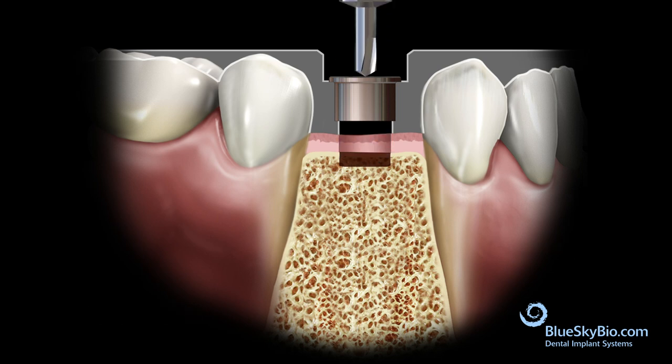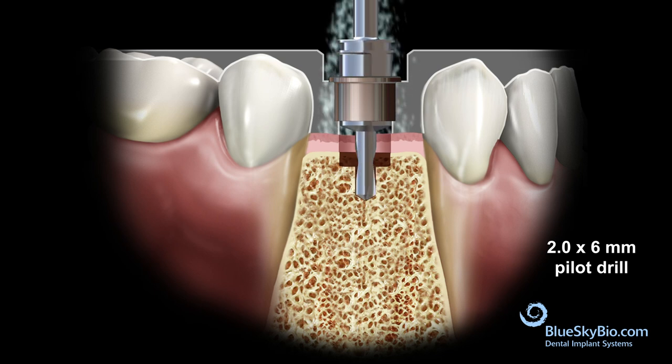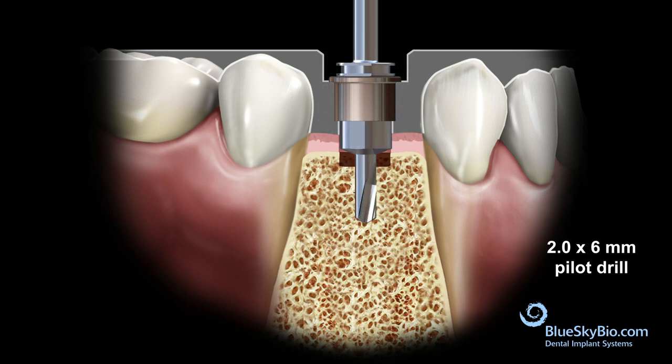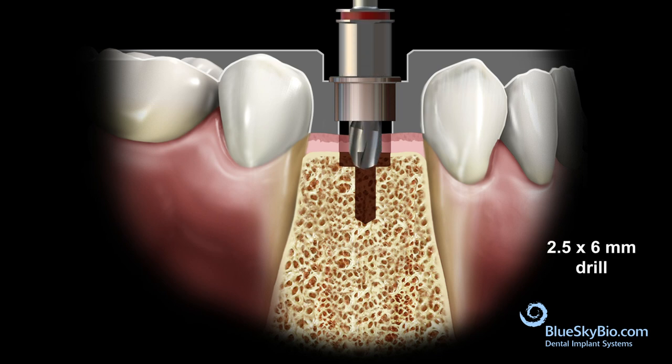Insert the 2 by 6 millimeter pilot drill without spinning until it advances to the depth created by the previous drill. Activate the drill and advance until stopped by the master tube. Repeat this process with each drill in the sequence until you've reached the appropriate osteotomy depth and diameter.